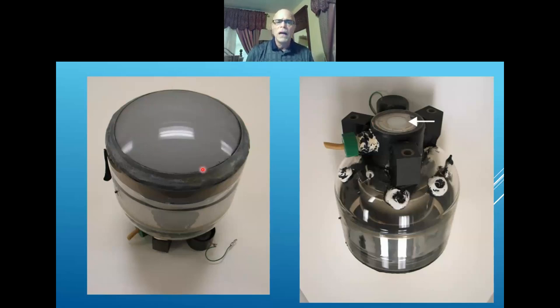But anyway, I wanted you to be able to appreciate what we're doing here. Our X-rays are going to be a remnant beam. It's going to be hitting this, going through several different layers, and that's what this little presentation, this video, is going to be about. Coming out of this small diameter output. So just think about it. We're focusing something really large down into something very small. So what does that sound like?